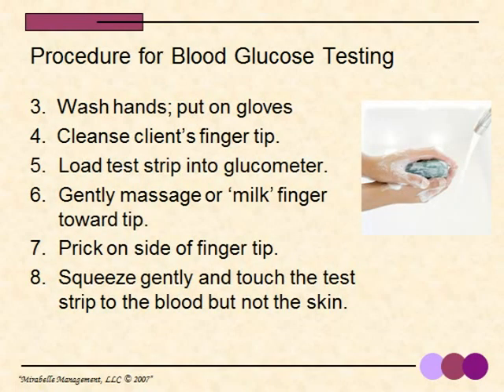Wash your hands and put on gloves. Cleanse the fingertip with a moist cotton ball. Load the test strip into the glucometer. Use only test strips designed for the meter you're using because not all devices and strips are compatible.